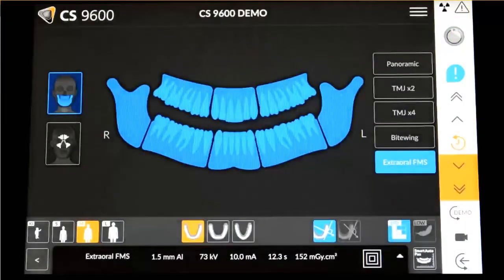Note: the Orthogonal Panoramic Trajectory Setting produces the x-ray beam perpendicular to the jaw, reducing premolar overlapping. It produces an image with a clearly visible alveolar crest for improved diagnostics. This is ideal for periodontal imaging and implant planning.